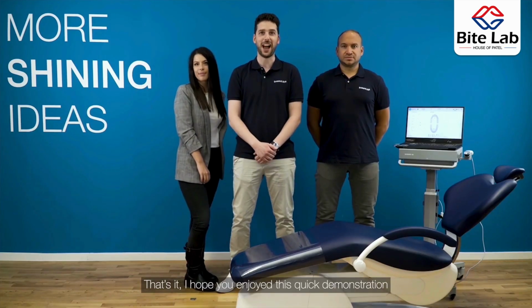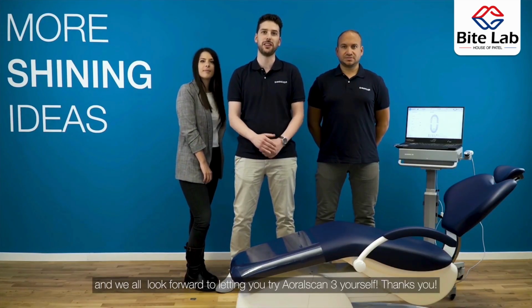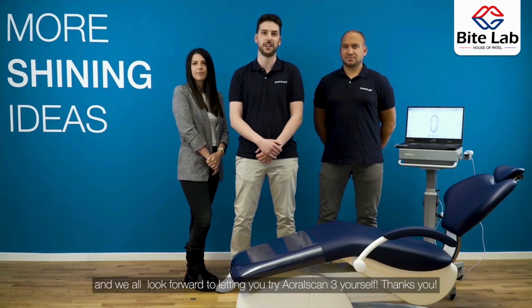That's it! I hope you enjoyed this quick demonstration, and we all look forward to letting you try Aoralscan 3 yourself. Thank you!